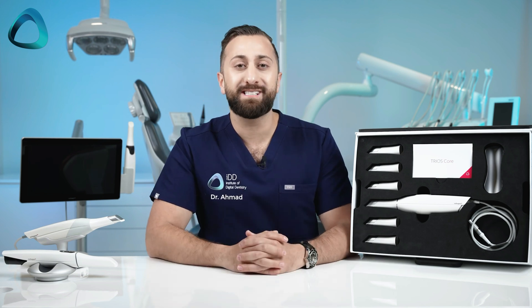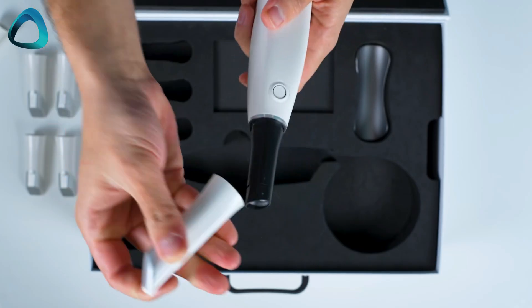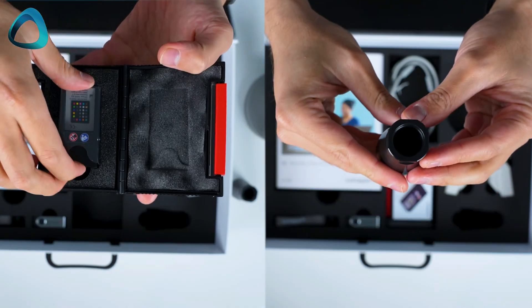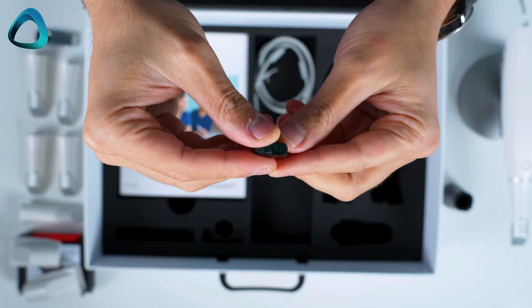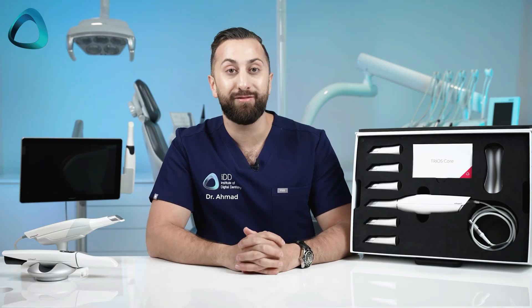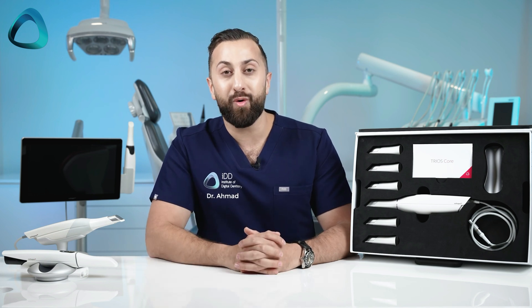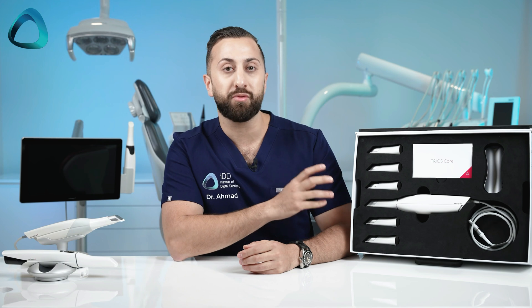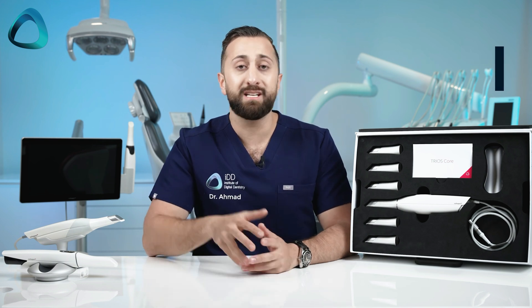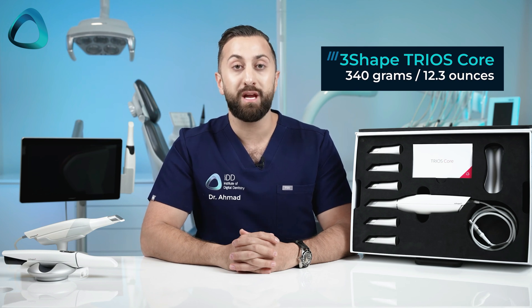So what do you get in the box? Well, it's very similar to the Trios 3 — almost identical actually — with the same scanner tips, calibration units, Trios 3 scanning pod, and licensed dongle. Note that this dongle will soon not be relevant thanks to everything going to the cloud. Overall, this is more like a Trios 3 than a brand new IP. It is also the same weight as the Trios 3, at 340 grams.